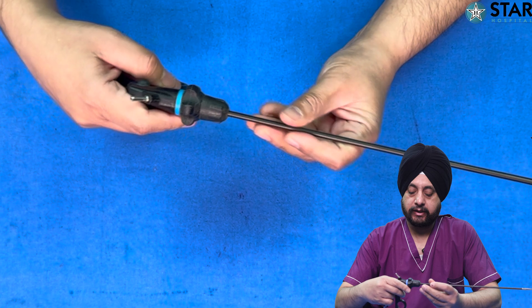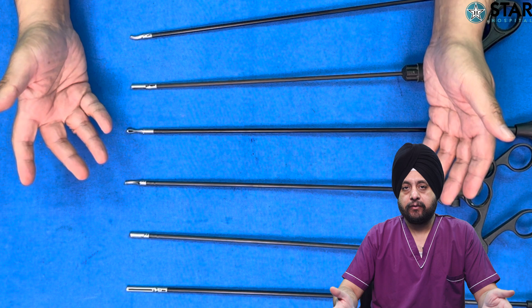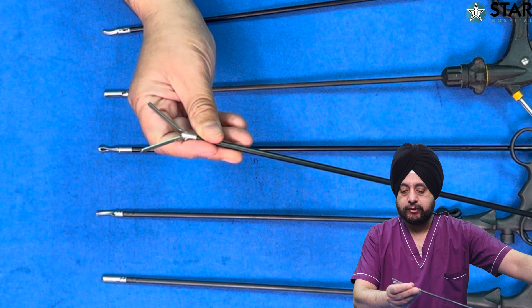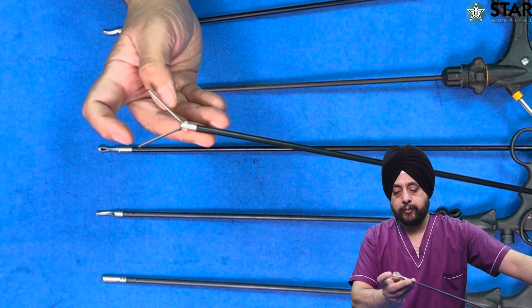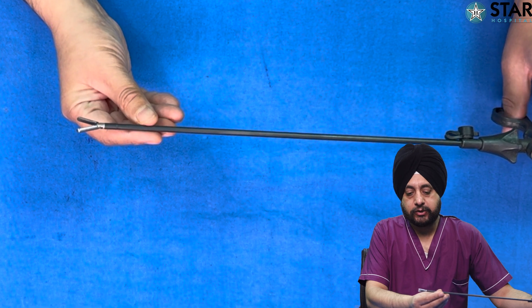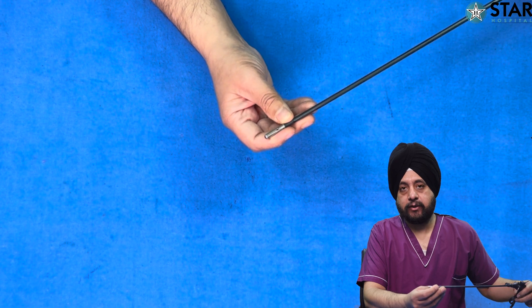Now we'll go through some of the common types of tips. The tip defines the instrument, and various kinds of tips are designed for various properties of tissue and parts of surgery. Here we have a bowel grasper — it is very broad and has perforations, used for holding the bowel. It is atraumatic; you just have to be gentle with the tissue, and because of the broad surface and bigger size this helps in preventing trauma. This one is a grasper usually used in the left hand to hold tissues — it is a little less traumatic as a blunt tip, so when inserting you do not injure tissue.